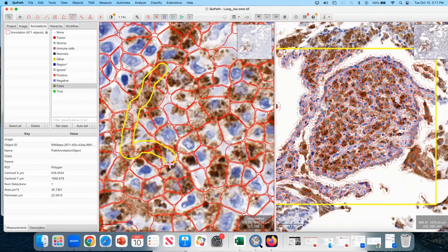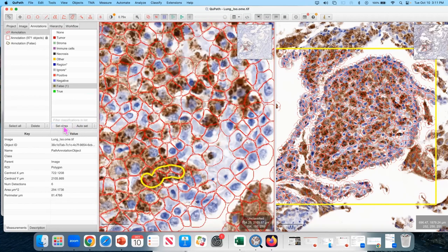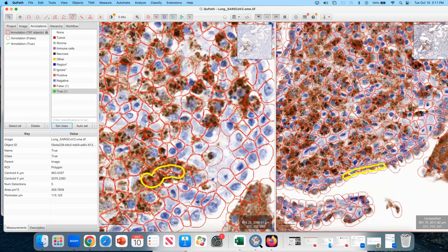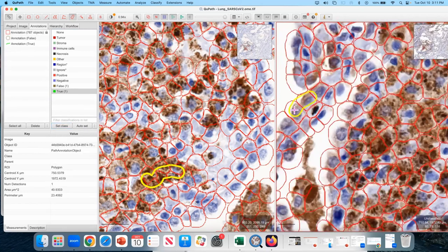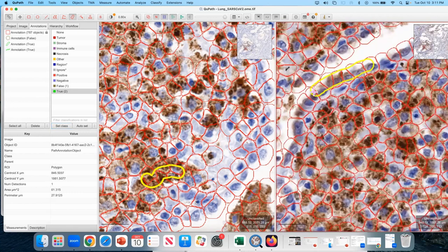And I know that cell detection is not ideal, but it's more about concept right now than about being super accurate on it. Okay, those are false. Those are false as well. These ones right here are true. And it probably will help me to look at the cells that do not have any DAB and annotate them by other. But I'm gonna start by just doing this, by just providing a few examples of my true and my false cells.